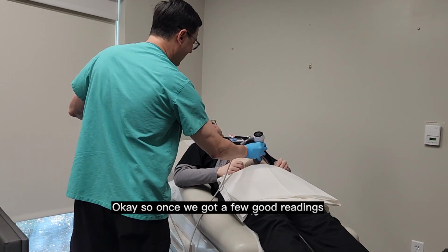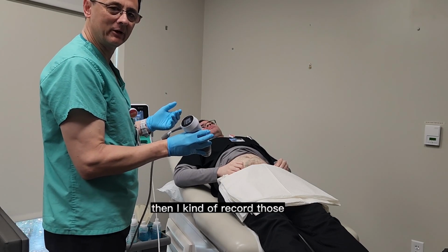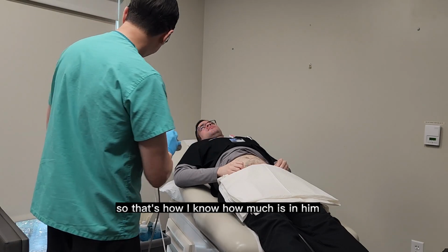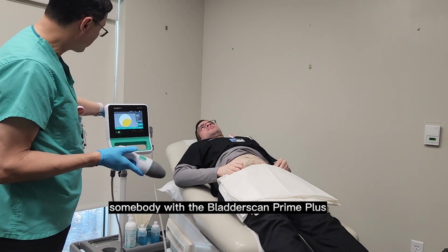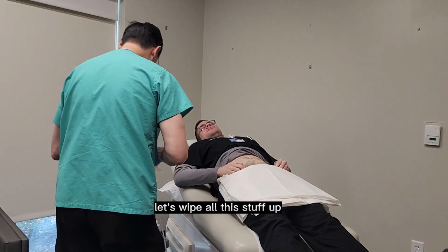Once we've got a few good readings, I record those and take the average. So that's how I know how much is in him. All right, and that's how you bladder scan somebody with the Bladder Scan Prime Plus. Okay, so right now, let's wipe all this stuff up.